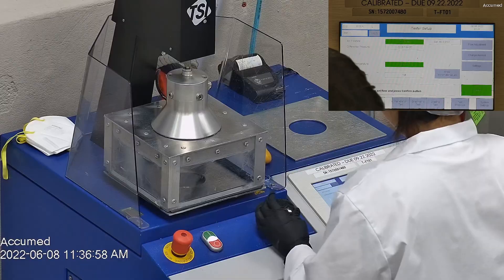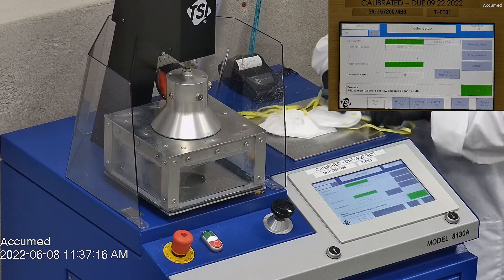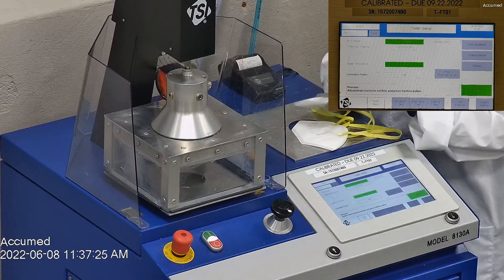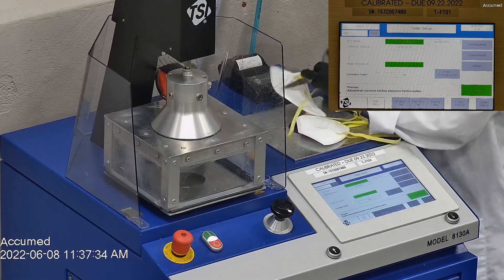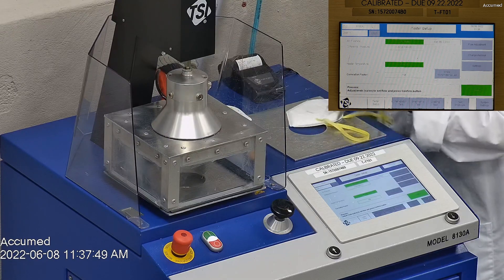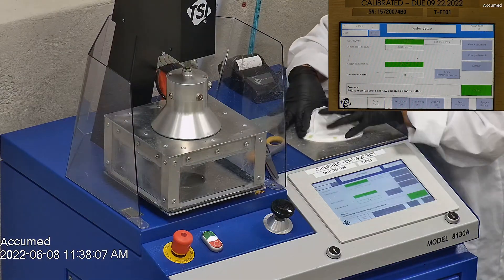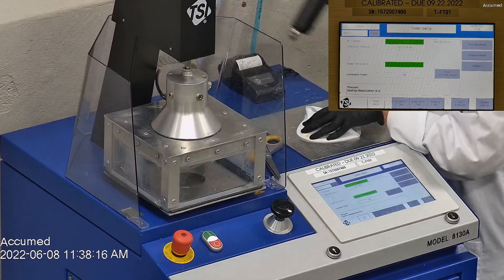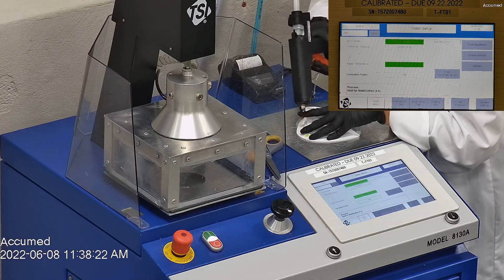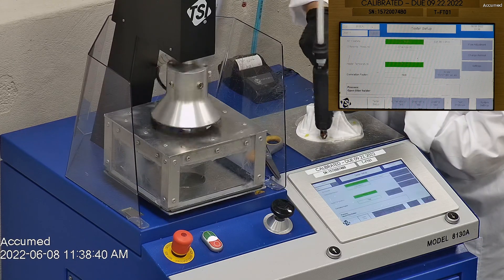We're going to see how these test on our TSI machine. We're going to be testing both the filtration efficiency and the pressure drop. This is our TSI machine, model 8130A, which is the same filtration testing machine that NIOSH uses to approve N95 respirators. Our procedure is inspired by NIOSH. We first run a tester setup and remove the headband from the respirator before placing it onto the testing plate to ensure a proper seal. Then we make sure the respirator is completely sealed with hot glue to ensure accurate results.